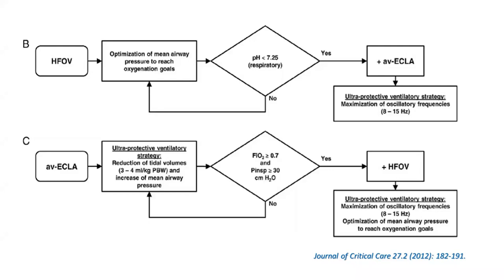This is what makes people drift away from using high frequency. I'm a strong believer in high frequency myself, from the experience we had over the last couple of decades. We saved a lot of kids like that, especially when you don't have the facility for VV ECMO in your center. In the cardiac ICU, I agree with Dr. Harvey that we are lacking the understanding of the cardiopulmonary interaction in the full picture. We can see the same concepts that we have talked about in conventional ventilation: the effect on the right ventricle, the left ventricle, recruiting the lung, PVR. But I think it is more complex than that. When you use it as a salvage therapy, definitely you're not going to get a great result to tell people it is a great modality. It is a salvage therapy, it's one of the modes. If you know how to do it right, maybe you'll get a good result. That's my conclusion on that.